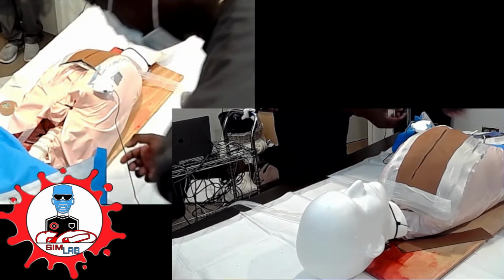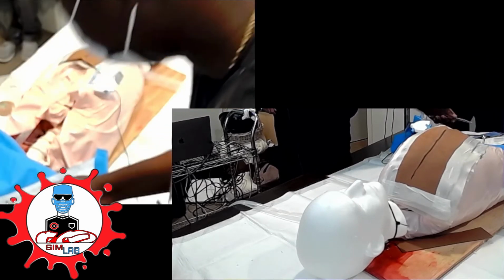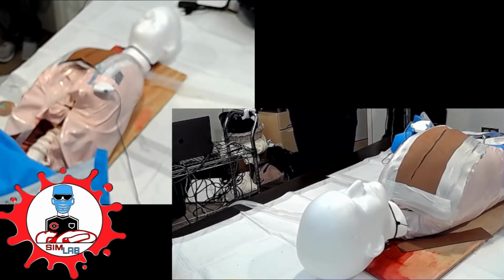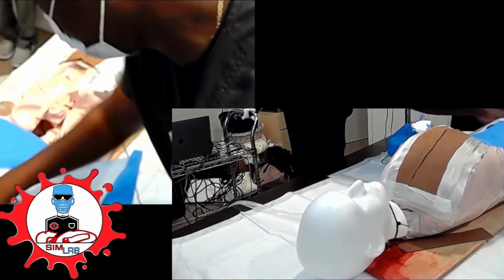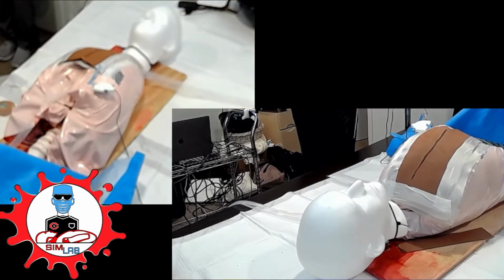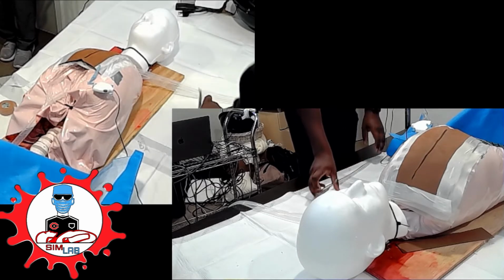So I guess, does everybody know where your chest tube tray is? Yes. In the heart cart. In the heart cart. So if you need a thoracotomy tray, you would request it. Does everybody know what the heart cart is? What is the heart cart? It's a cart made for hearts, right? And where is it? Behind the other cart. So on the blue side, hiding behind the procedure cart is the heart cart. Watch out for a second, I'm going to bring it in and show it to you real quick without occupying too much space.